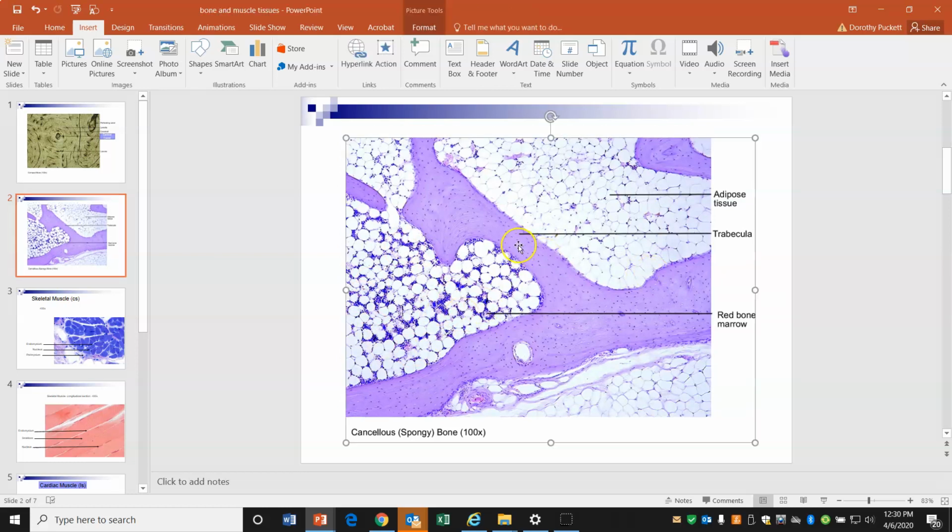You see osteocytes, and in between those osteocytes, the lighter purple is matrix. So the matrix, or extracellular matrix, is made up of fibers, which are collagen fibers, and also a hardened inorganic matrix, which we call hydroxyapatite.